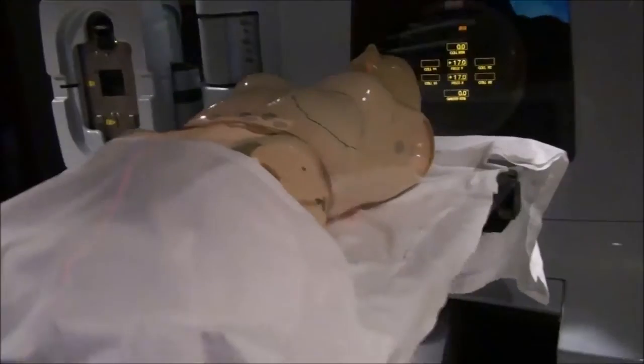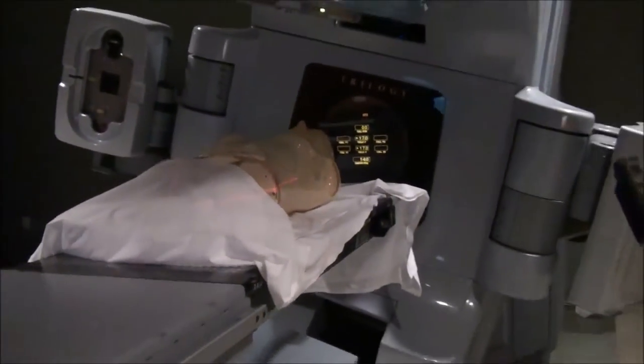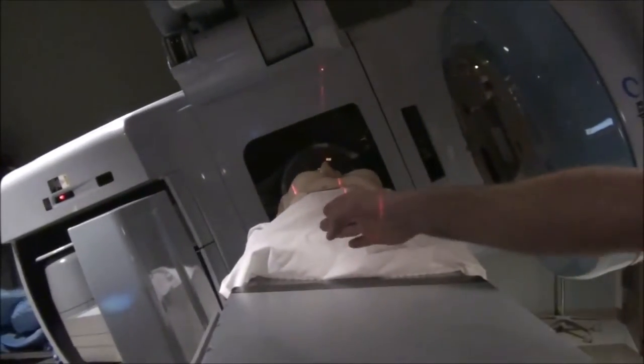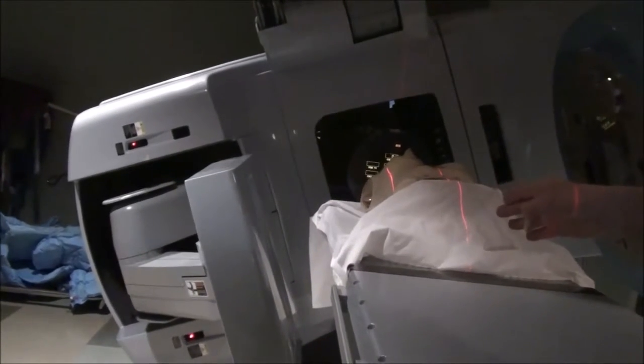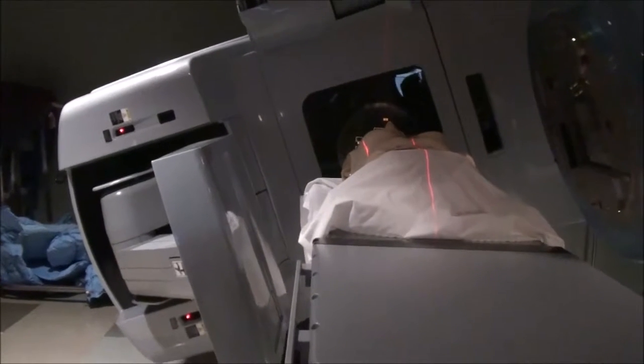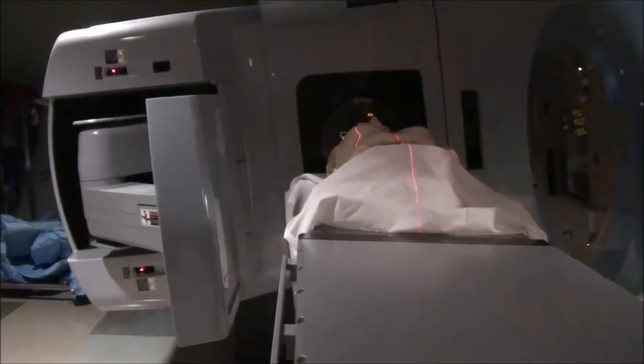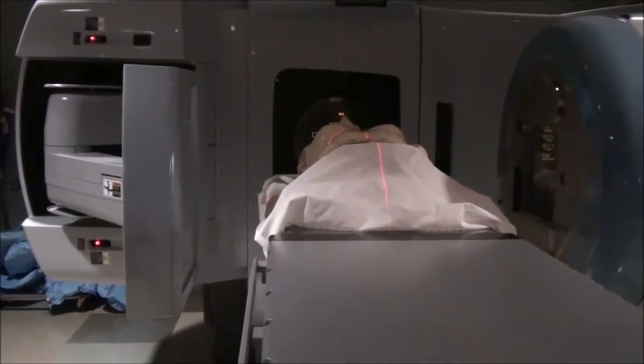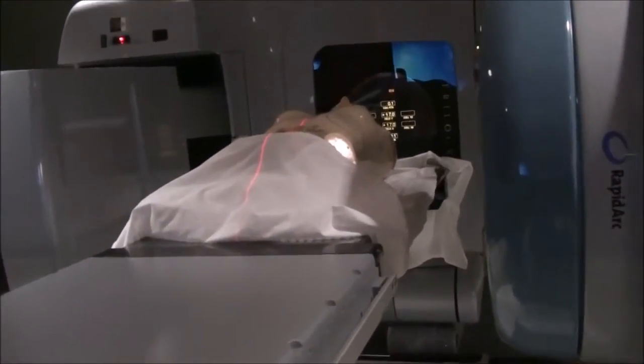We're going to go ahead and rotate to a lateral. Making sure that you clear all the way around — typically you stand where the camera is and look to make sure. More often than not, you're going to have an incident with the table and the image intensifier rather than with your patient. So that's where to look first. I'll harp on that a bunch because I've seen people run the image intensifier into the table, and I've done it myself.